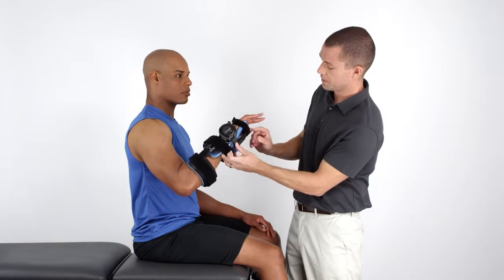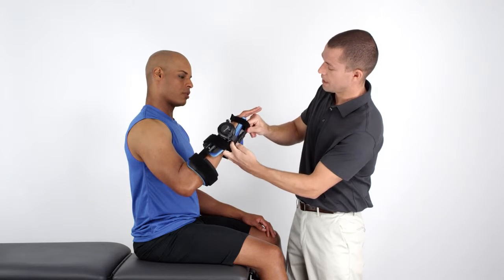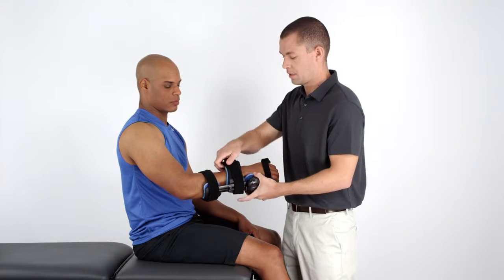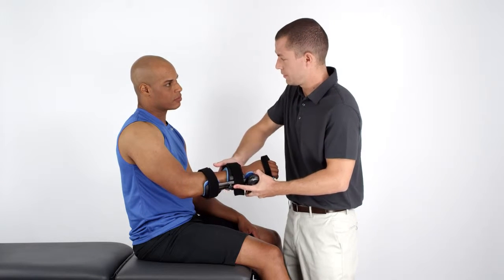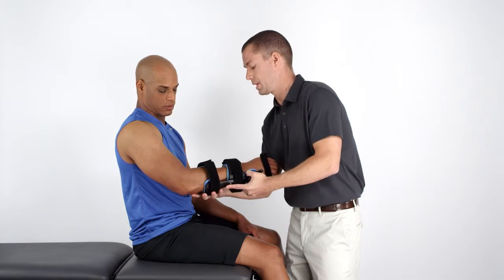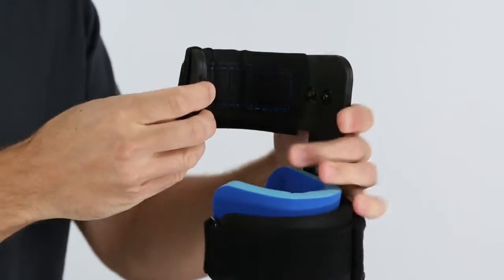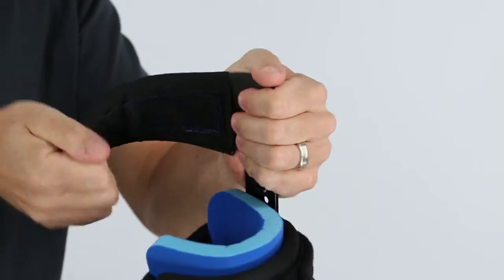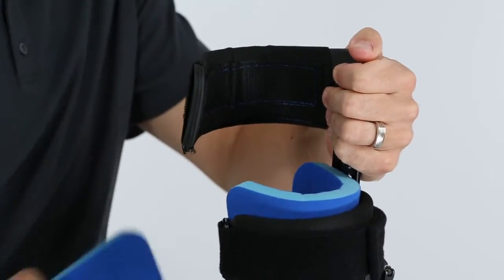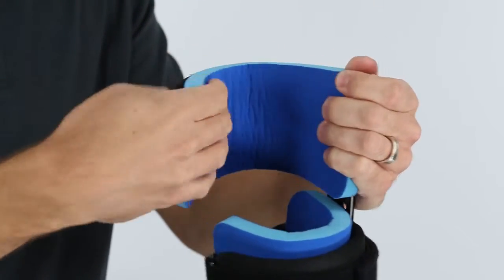Next, adjust the palm bar for comfort and support by depressing the leaf pin. Then lengthen or shorten the bar as needed. After you've properly adjusted the struts, shape and mold the bendable contour cuffs to the patient's limb to assure a snug yet comfortable fit. The unique contour cuffs are made of an aluminum insert and rubberized coating that enable you to bend and twist the cuffs easily. The blue memory foam pads, which are attached to the cuffs by Velcro, may also be repositioned or even trimmed and sized to maximize fit and comfort.